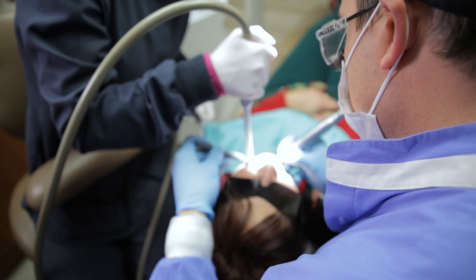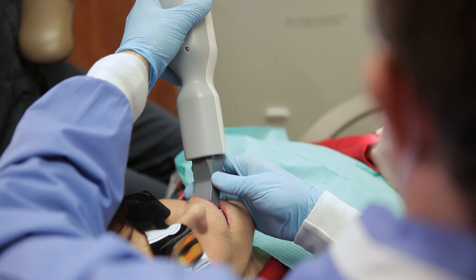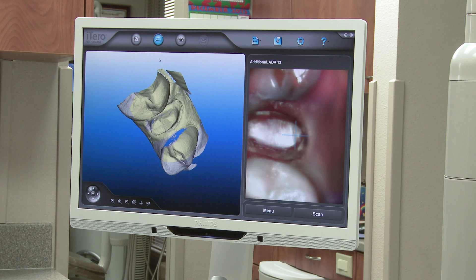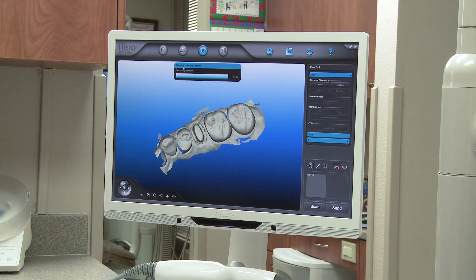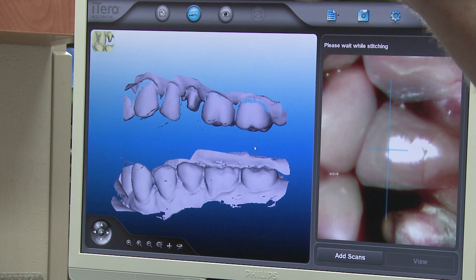Then the patient's tooth is prepped with standard tissue management techniques. Scanning of the prepared teeth can then begin immediately, with no powder needed prior to scanning. The doctor scans the occlusal, lingual, and buccal surfaces, contacts, adjacent arch, and then bite.